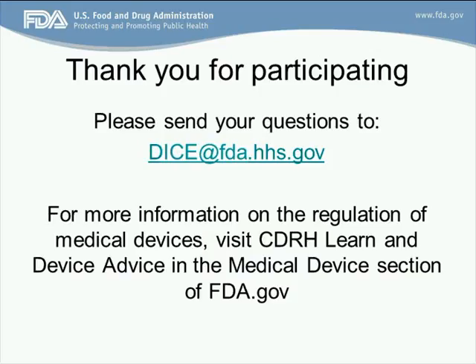Yes, I just had a question about whether there is some mapping between this and the usability standard for medical devices, the IEC, I think it's 62366? We did take a look at 62366. We looked more at ISO IEC 60601-1-11, which is the home use medical equipment standard. And we also looked at the HE 75 standard for human factors. There was a little bit of looking at 62366, especially in the quality assurance portion, but it was mostly with the 60601 and HE 75.